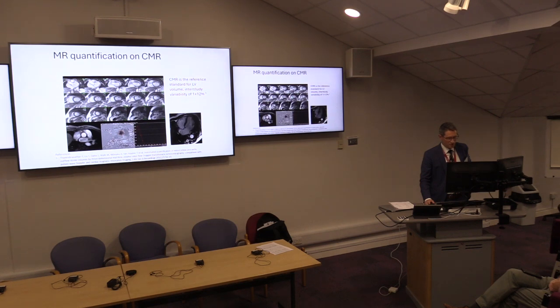And we do this routinely actually, because it's a check for me about stroke volume in any patient, but particularly in MR. What you're effectively doing is you're generating EF, EDV, ESV from your short axis stack. And obviously if some of that blood is going back into your left atrium, not all of it's going to end up in the aorta. So the difference between this stroke volume and the stroke volume you've generated from your contours is your MR regurgitant volume.